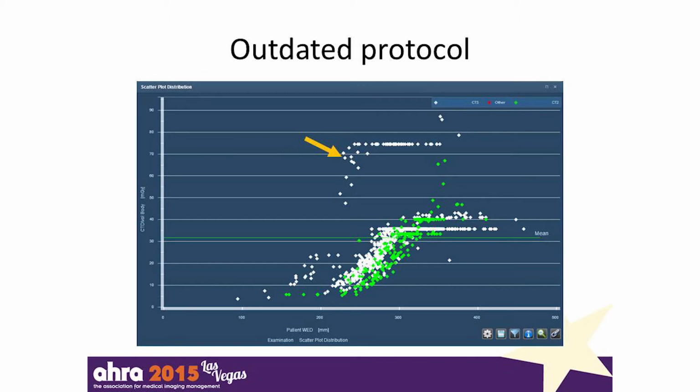But the thing I really wanted to highlight today is these points here that follow a completely different trend than all the others. What's going on there is these were all the same protocol, but this was an outdated protocol that was still in the scanner and was being used. It was from several years ago. The protocol had been changed and the dose was reduced, and they did not know this was still in clinical use.